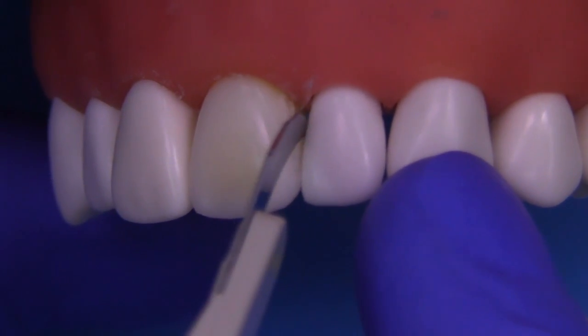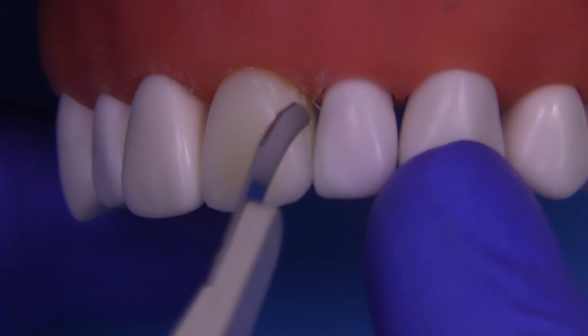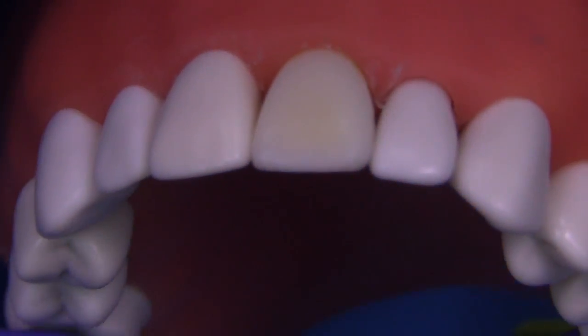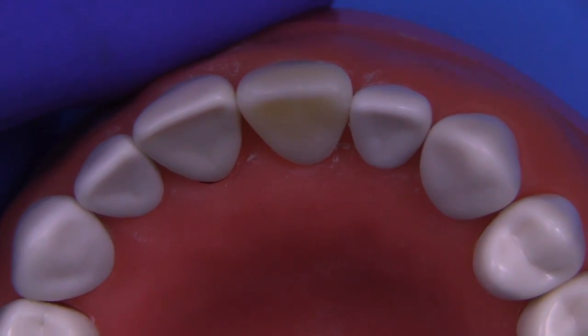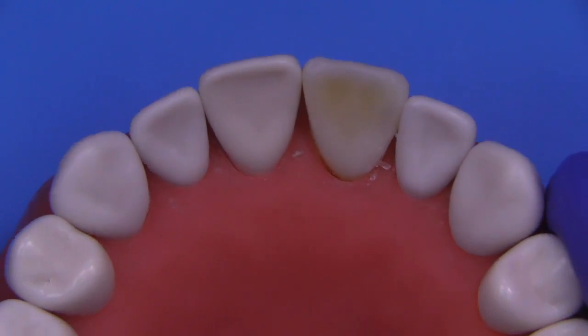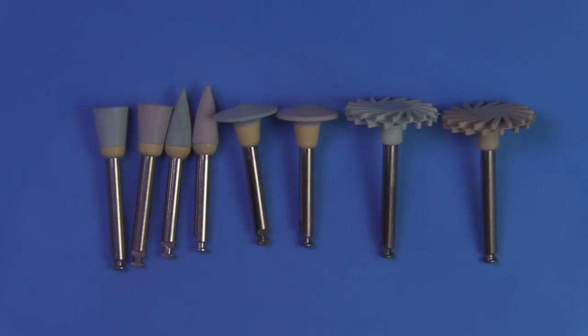You can see I'm turning the instrument into the tooth as I remove the flash. You could use a finishing strip if you like, whatever it takes to remove the flash approximately. And now we're ready to go with polishing and contouring at the same time because we have flash.